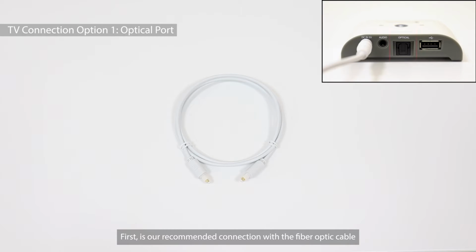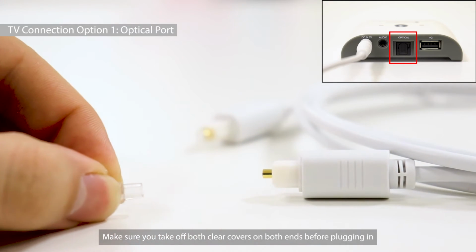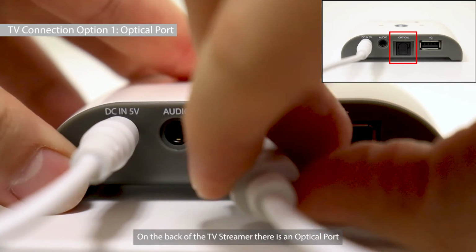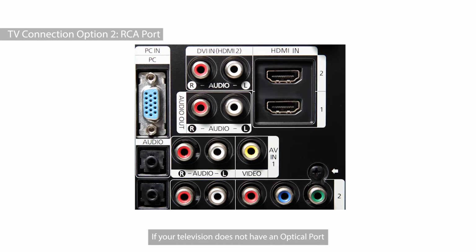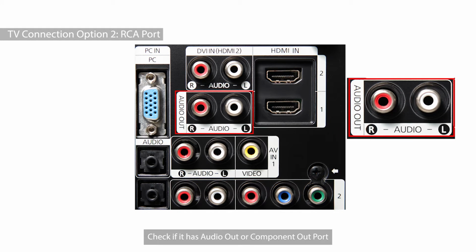First is our recommended connection with the fiber optic cable. Make sure you take off both clear covers on both ends before plugging in. On the back of the TV streamer, there is an optical port. Plug one end here. Then plug the other end into the TV's optical port.